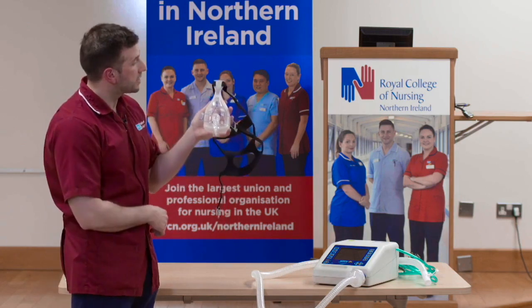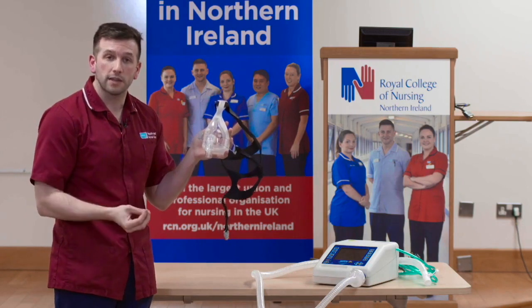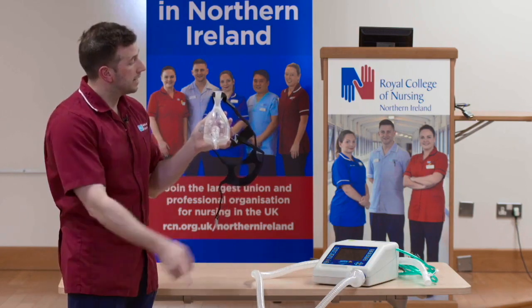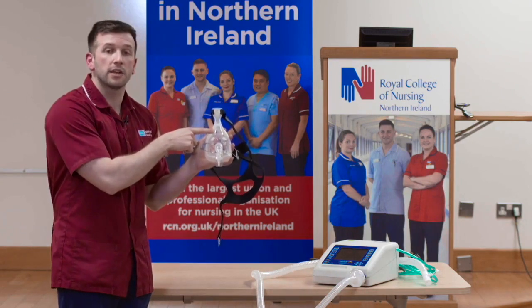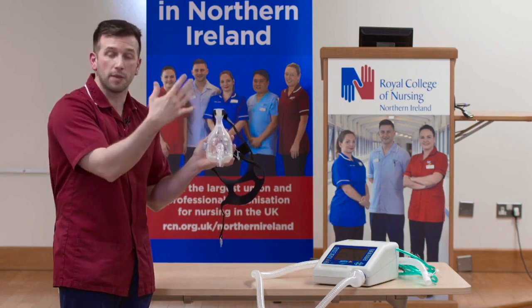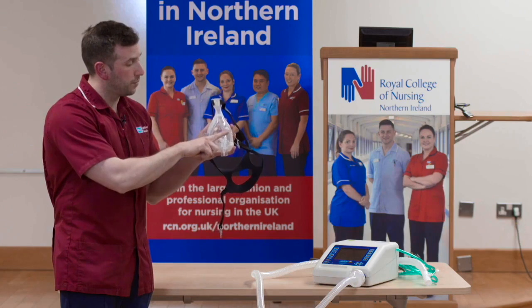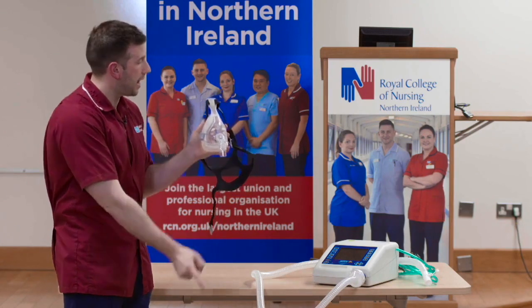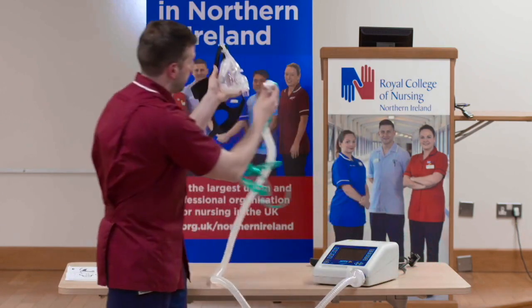The components of this mask is that this is called a vented full face mask. And what I mean by that is that you can see here in the mask that you get vents on the top of the mask to allow for, as the patient breathes out, their expired gas can escape the mask and into the atmosphere. You'll see here the elbow of the mask, and the elbow connects to your oxygen entrainment port like so.